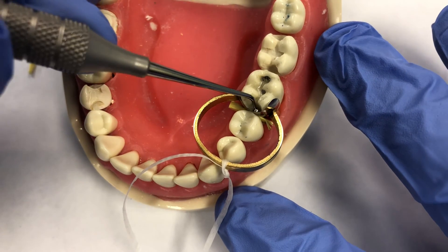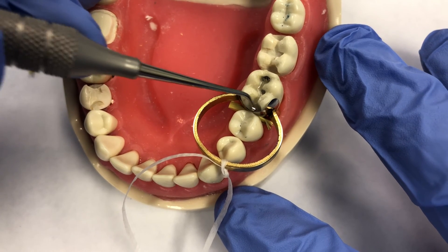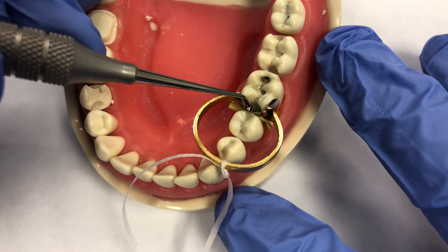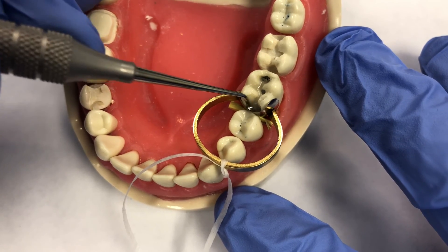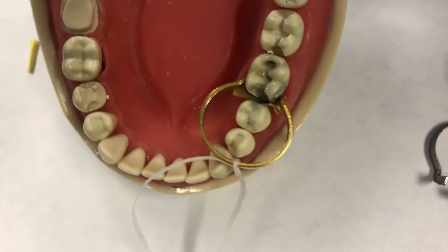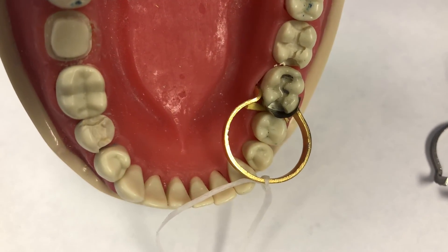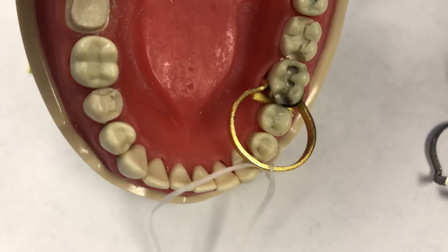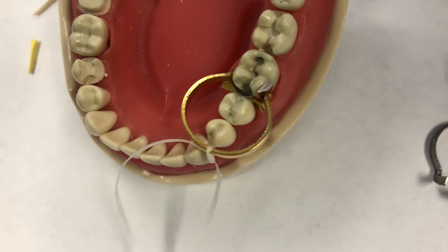There are some really nice systems out there that straddle the wedge and have a V-shaped footprint. But it doesn't matter what you have — you always work with what you've got. We have a sectional matrix set up for this MO preparation. Most doctors will use a sectional matrix if they're doing a composite, but in theory it could be used for amalgam as well.